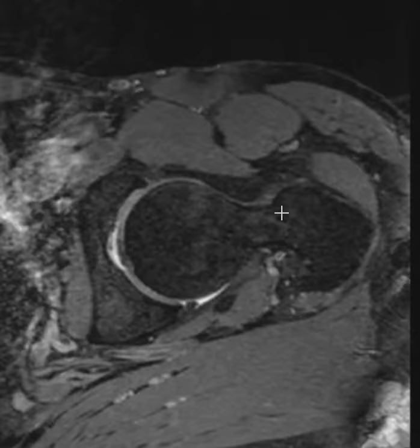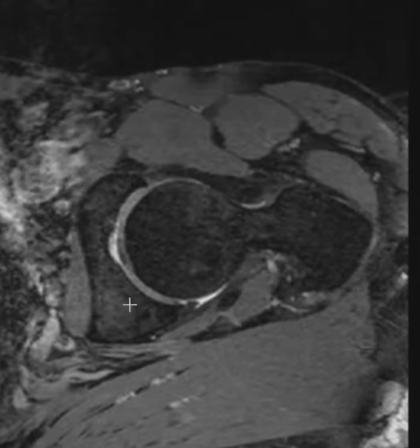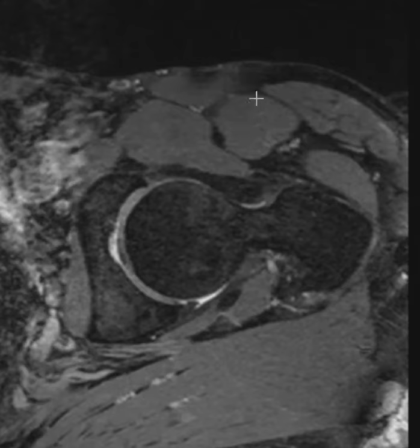This is her left hip, and this is just one sequence of the left hip that shows the femoral head. Within the cup here — the acetabulum — this is the anterior acetabulum, this is the posterior acetabulum, this is the front of the hip, this is the buttock back here, the gluteus maximus muscle.